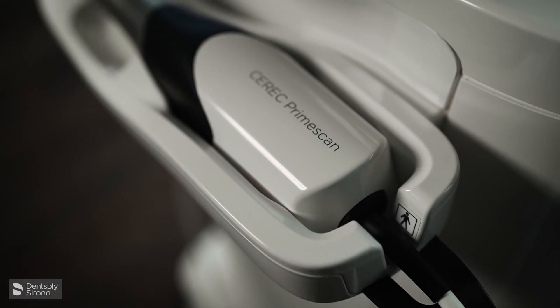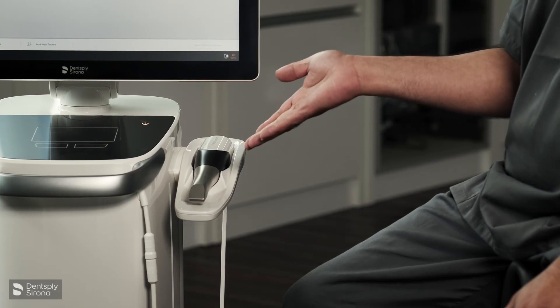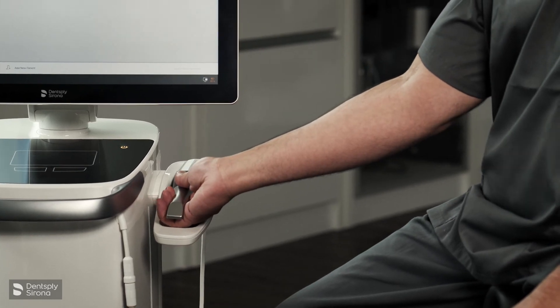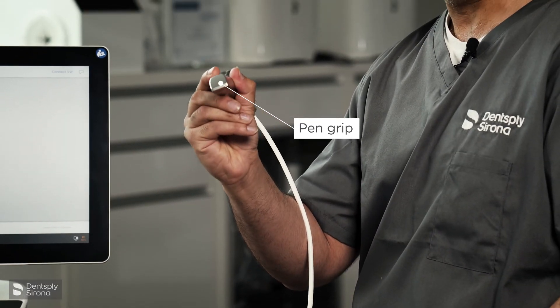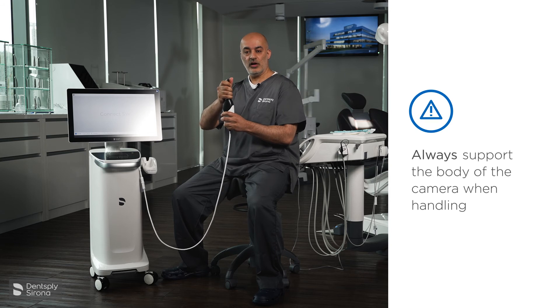The Prime Scan camera has an ergonomic design and handling is important. To remove the camera, we place our hand underneath the camera with our thumb on top to support it, and we lift up. To hold it, we hold it like a pen grip. Just a word of warning — please don't hold the camera at the top.